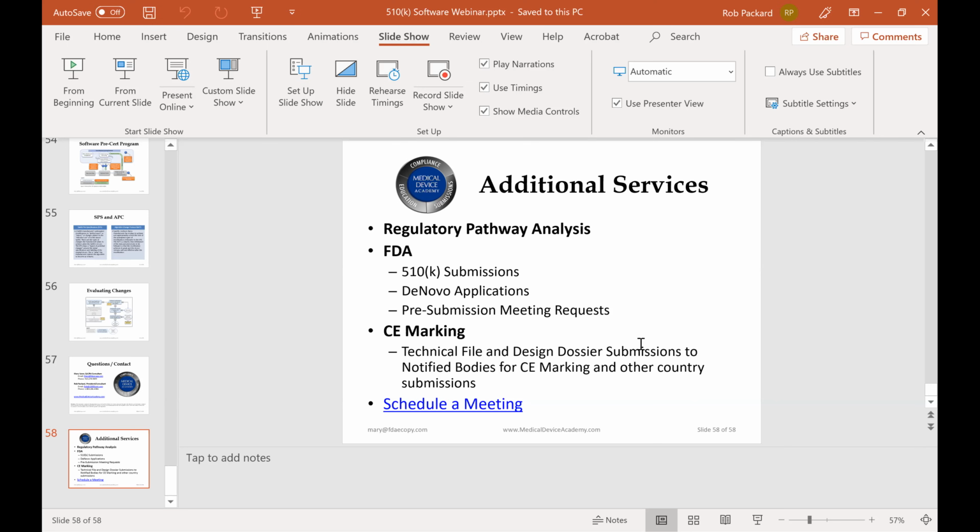Now, over time, particularly with software products, you make lots of bug fixes. Every single one of those bug fixes does not mean you have to do a 510K. Usually the answer will be letter to file. But after you've fixed a lot of bugs and you've adjusted to new operating system releases, and maybe even added a little feature and maybe made a little tweak to the user interface or maybe changed the color, every single one of those changes is cumulative.